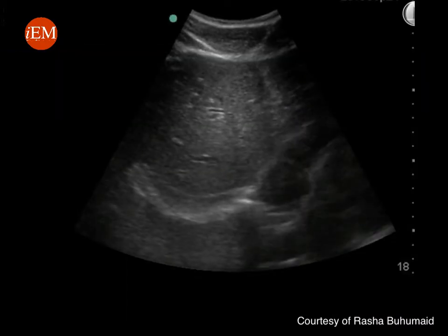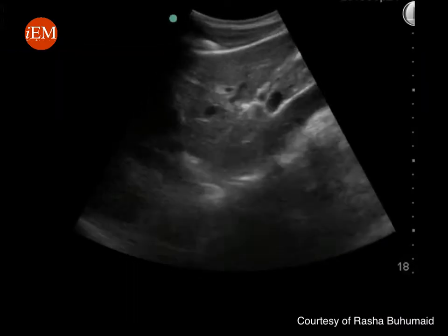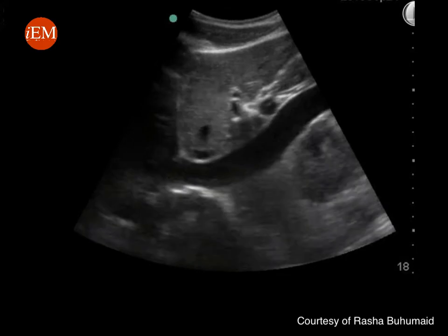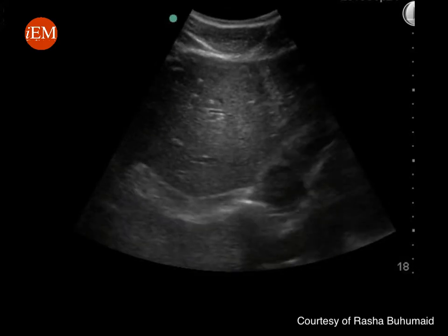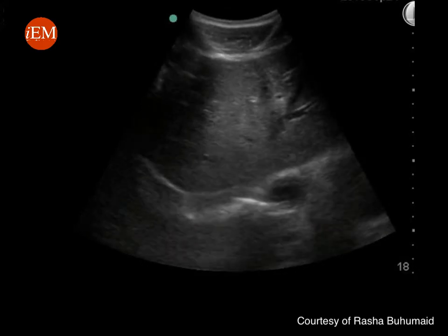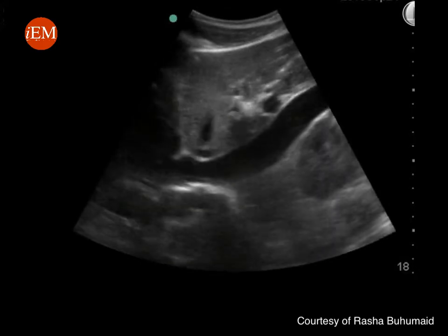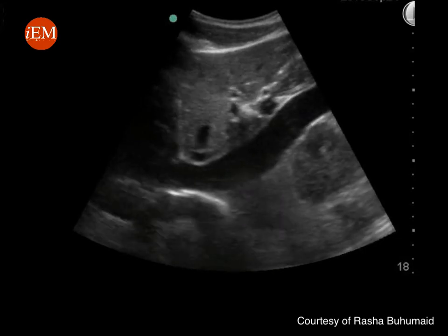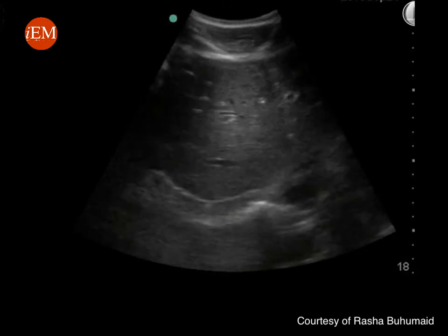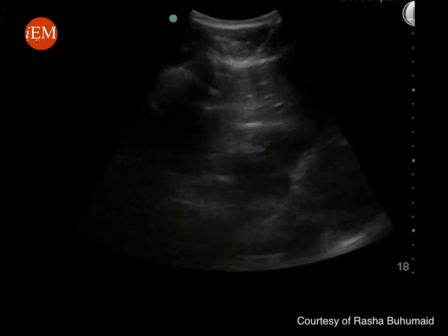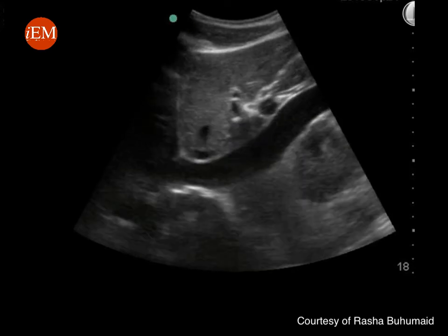This is the corresponding video of how to image the IVC. You will see we'll start by getting a sub-xiphoid view of the heart, then rotate the probe, and you will see that the IVC is draining into the right atrium.